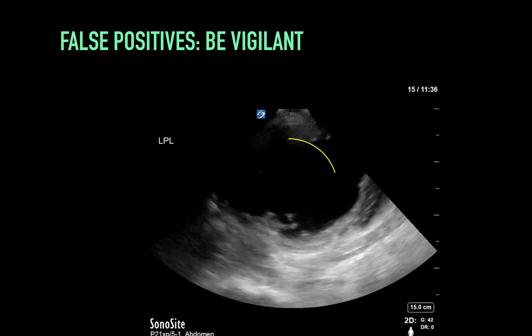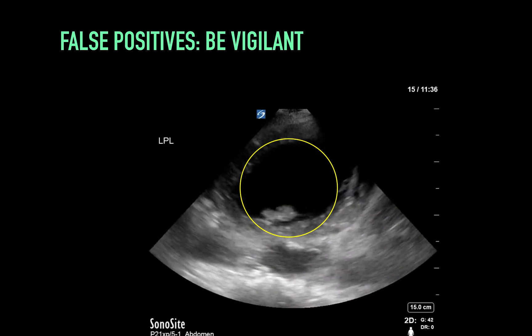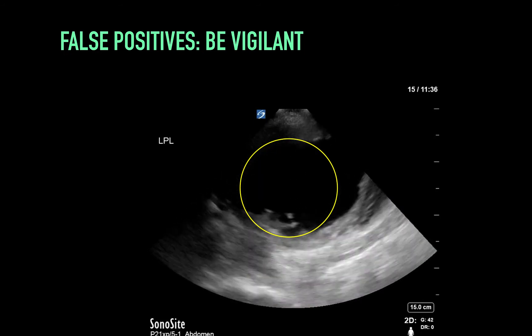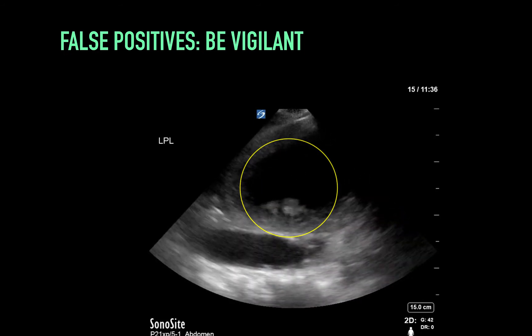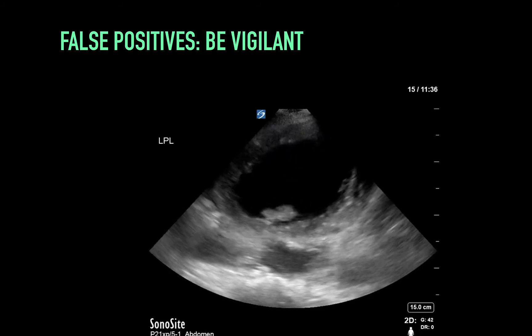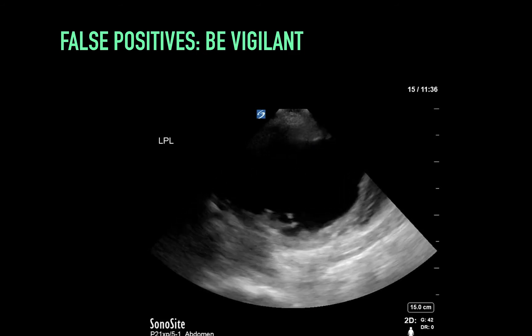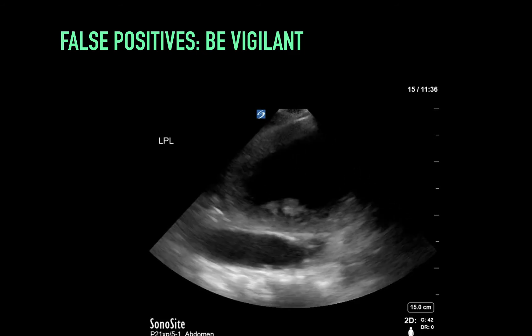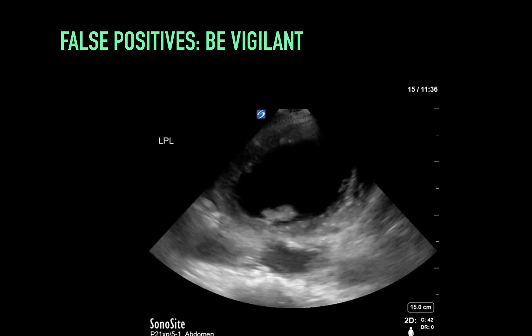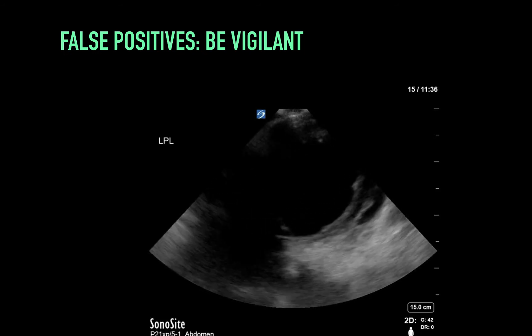In this case, we see a large anechoic space — but notice it is beating. That's because this is the heart. This is a very large heart; this patient had cardiomegaly with a heart encompassing almost the entire left thorax. This is one important false positive you really don't want to miss.